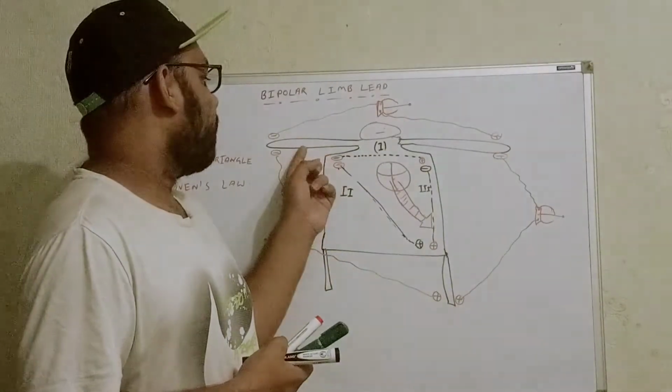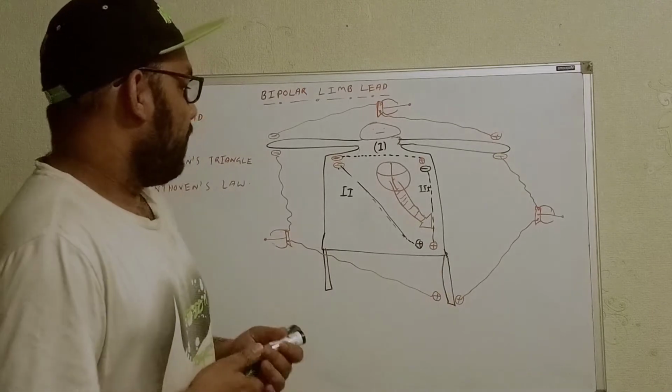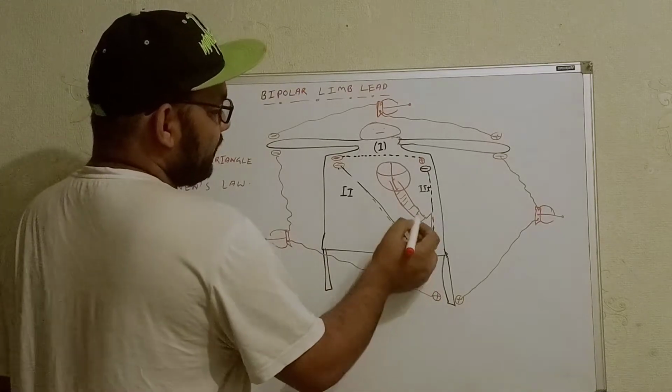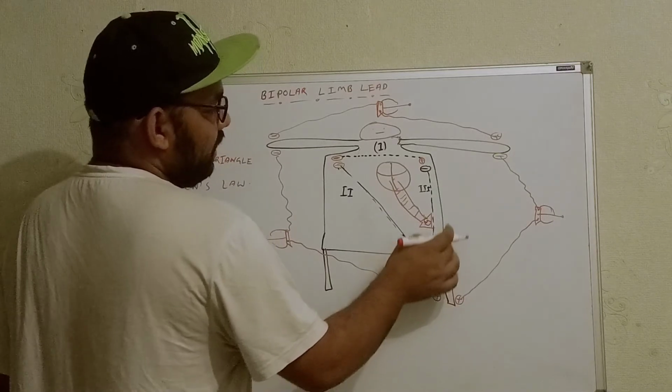So the same things will go over here and also in the lower limbs. Now I have taken these two parts over here. Okay. Now see, for understanding purpose, let me see one thing over here, the potentials. See, this is going left and downward. So definitely the potential here will be more positive, and this is the left side.